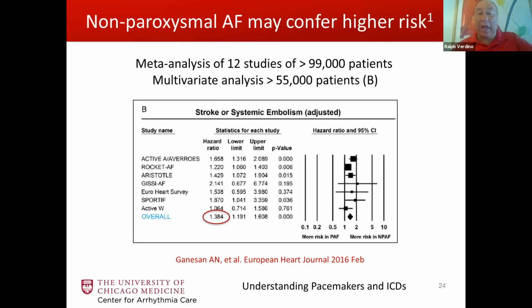Is that a 6-hour episode, or a 6-hour total burden? Excellent question. Right now we're using two things: any episode lasting more than 6 hours, and an AFib burden of around 5%. That's arbitrary, like I said, a moving target. Once again, it all depends on the individual patient. I might be more worried about a patient who has an AFib burden less than that and be aggressive about anticoagulation. But that's currently what we tell our device nurses to bring to our attention when they see something like this. I thought this was kind of interesting.